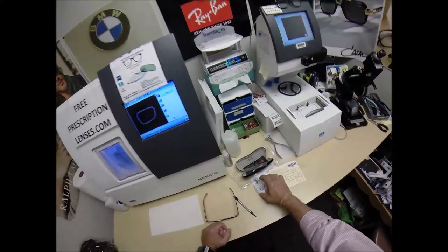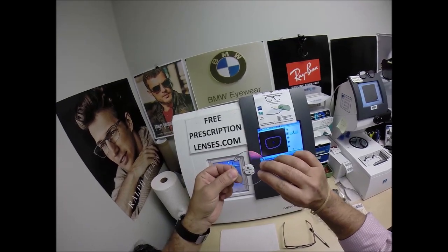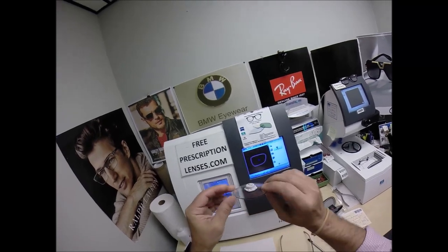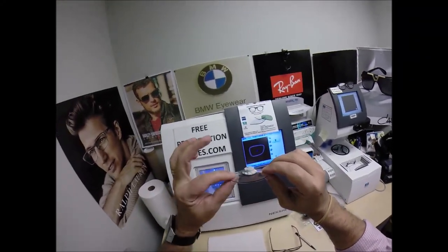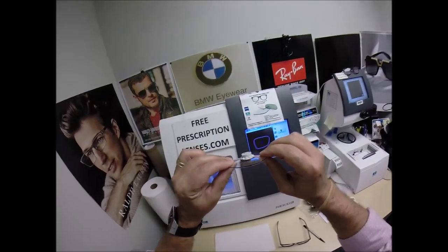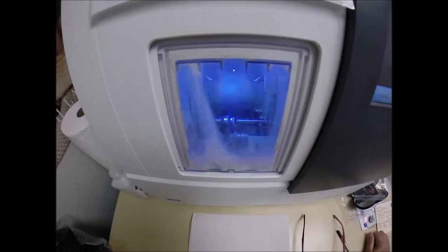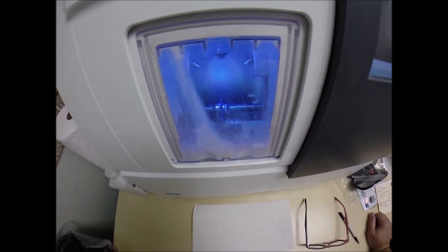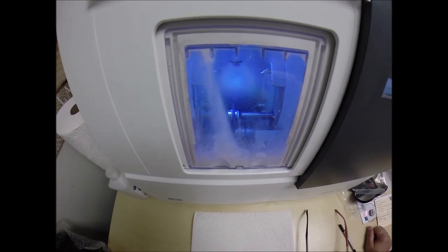Victor got a lot of specialty add-ons in his lenses. He's got the red flash mirror on the front of the lens. He has the Duravision Sun back surface anti-glare coating. He's got 50-70% blue light protection built into the Photofusion Extra Gray element of this lens. The last few years, everyone's been focused on the blue light emitted from today's electronic devices such as cell phones, tablets, computer screens, and of course the number one source of blue light on the planet — the sun.